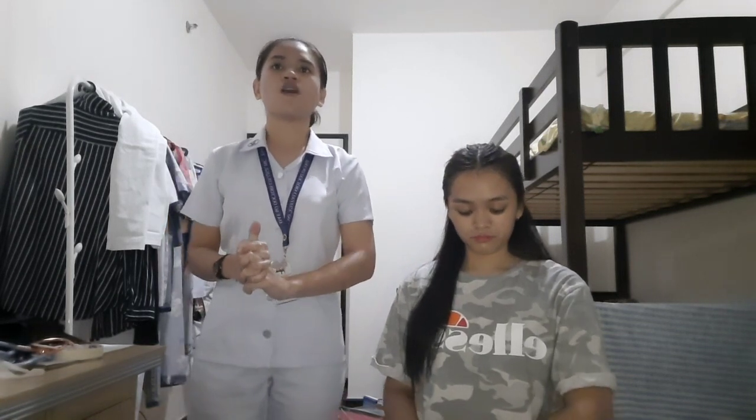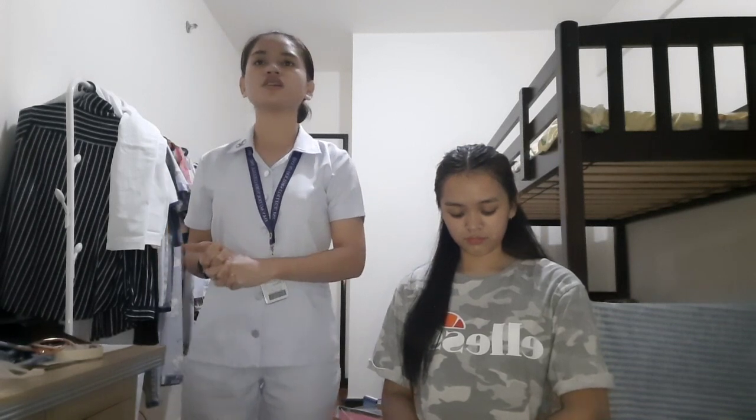After that, I will make sure that the client has not smoked a cigarette, ingested beverages that contain caffeine, or has had any strenuous activity within 30 minutes. Nicotine causes vasoconstriction in peripheral and coronary blood vessels, which may cause an increase in blood pressure. Caffeine is a stimulant that increases blood pressure. Strenuous activity also increases blood pressure.